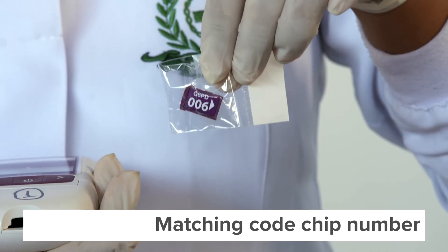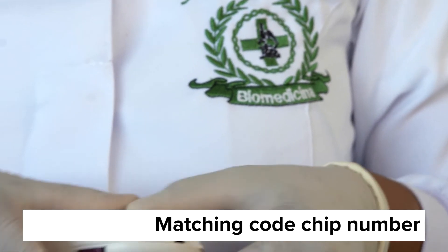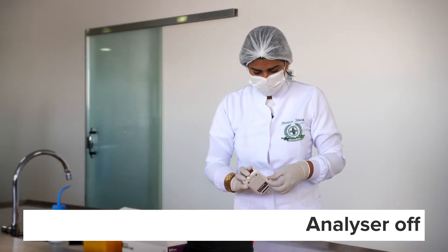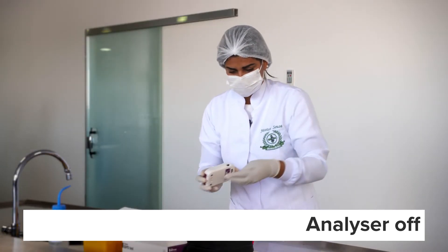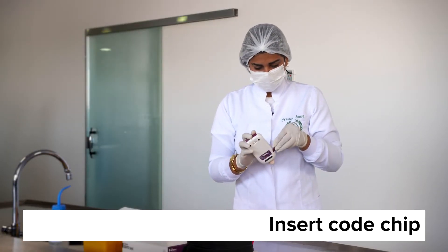Check the number on the code chip matches the number on the test device foil pouch and make sure the analyzer is turned off, then insert the new code chip into the analyzer.